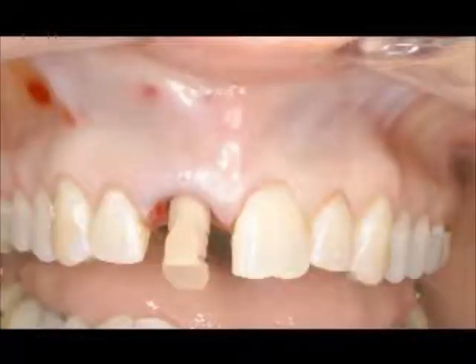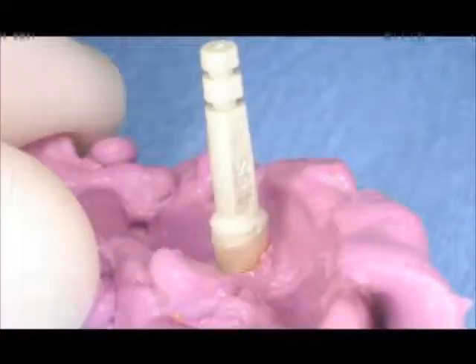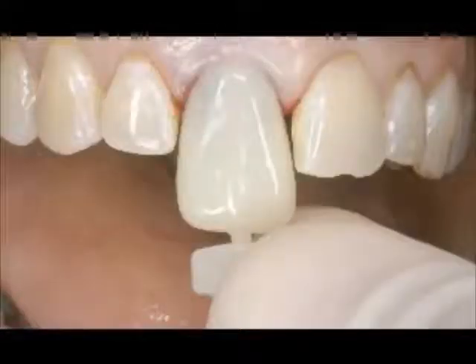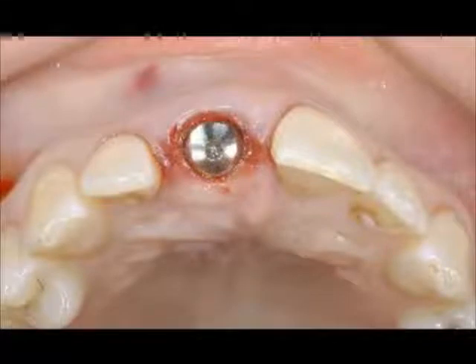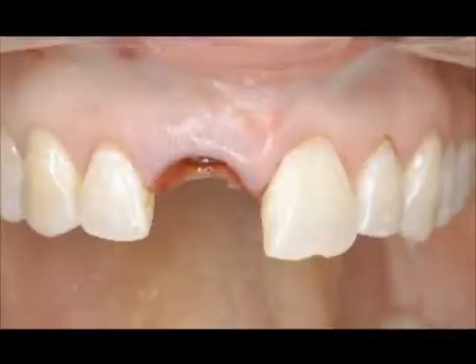Now this is one option. We can pick up this in the impression and then secure the analog onto the impression cap and send it off to the laboratory. Or we can also utilize the temp-based cap and pick up and reline a temporary restoration. Or we can go back to the old way of doing things and just wait till second stage or 2 months later and place in a healing abutment.